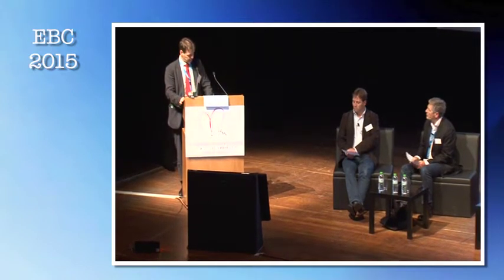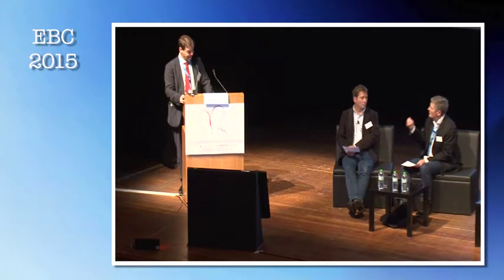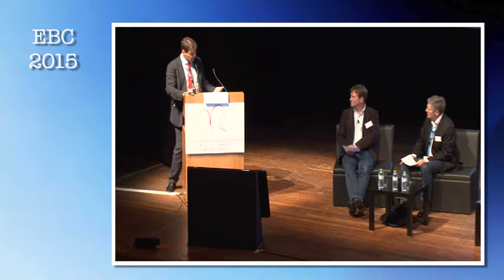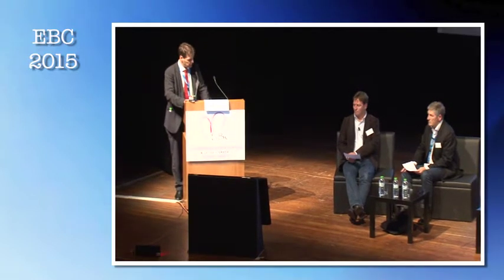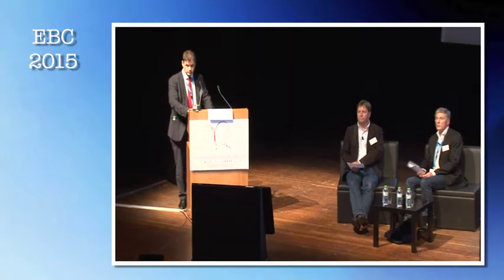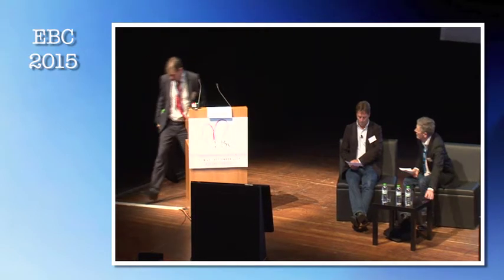Okay, I think it's a very important point. Of course, 30 seconds in the left main is a little bit long. So what is your recommendation? 2 times 15? That's what our clinical practice is. We just follow the blood pressure and see how the patient is tolerating. It depends, if it's a very large right coronary artery, you know all the tricks. But just like absorption, sometimes we deflate and we do a second inflation just to keep our time there. Do we have questions in the audience or comments? Okay, if not, thank you very much.